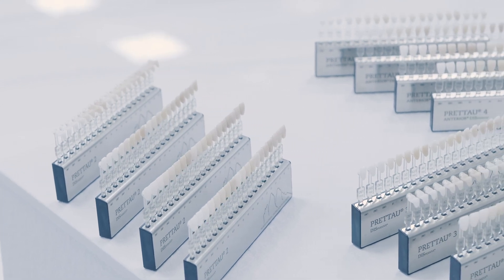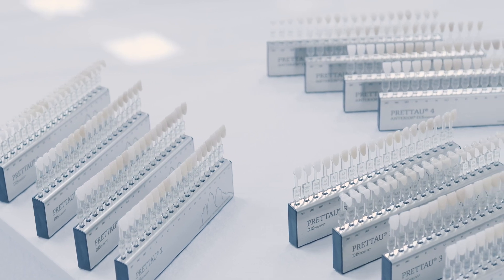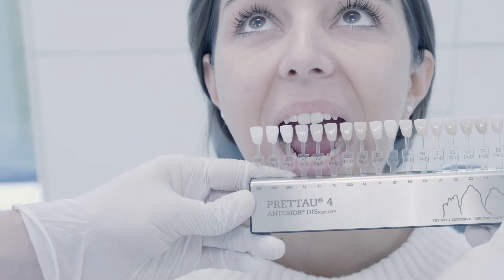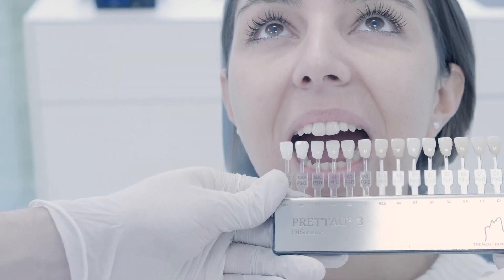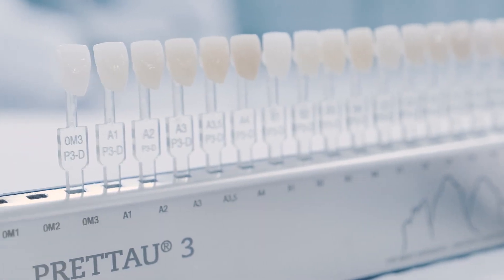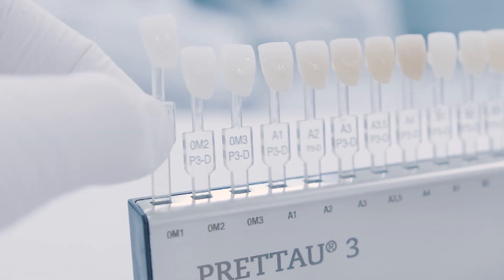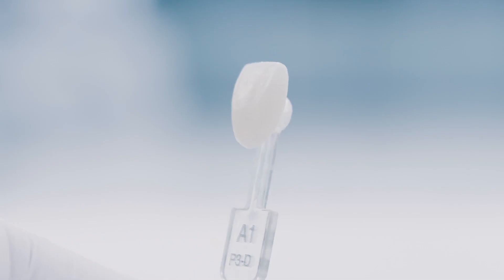With the three pretout dispersive zirconia types, three degrees of translucency are available. In addition to Pretout 2 Dispersive and Pretout 4 Anterior Dispersive, the new Pretout 3 Dispersive zirconia is also available. The color spectrum is inspired by the Vita Classic range and comprises 16 dentine shades and three bleach shades. The sample teeth are monolithic and glazed with 3D Base Glaze.